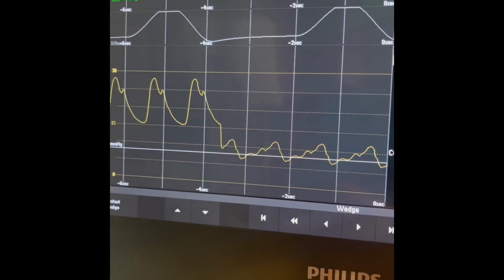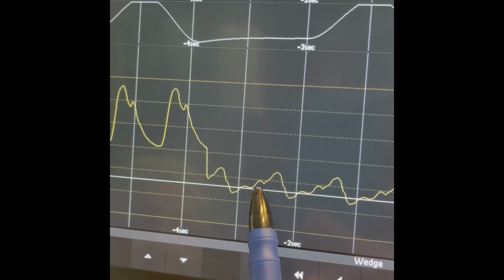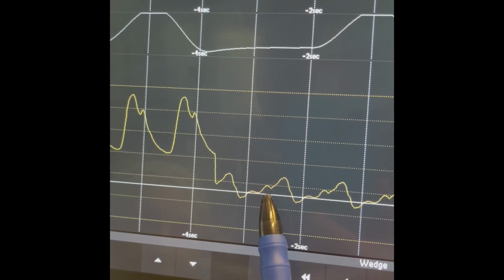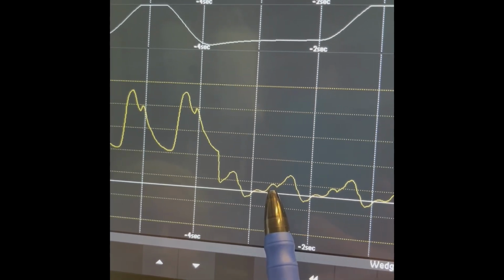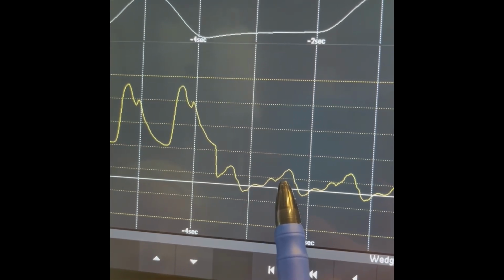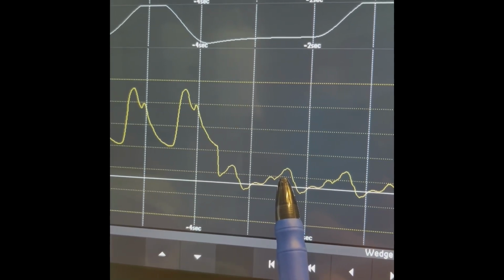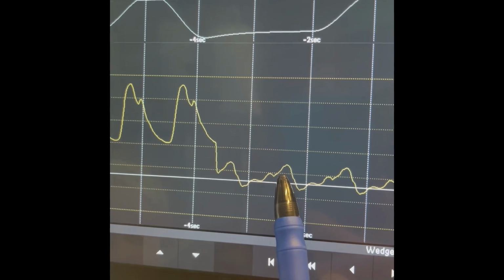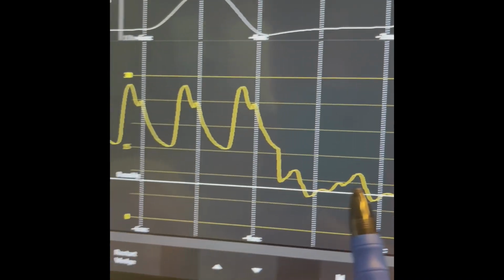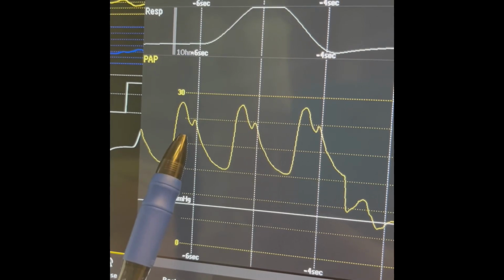Okay, so first we have our A wave, which is going to represent peak atrial contraction during ventricular diastole and atrial systole. This is also a good measure of our left ventricle end diastolic pressure on the wedge waveform. Then we have our V wave, which is going to represent atrial filling. At this time, the mitral valve and the tricuspid valve are closed. During the TP interval on your EKG tracing, the atria begin to empty when the valves are open. We also have our dicrotic notch on this PA waveform, which is going to represent valve closure.